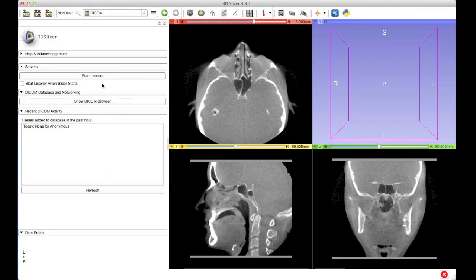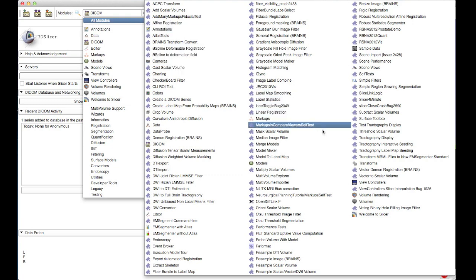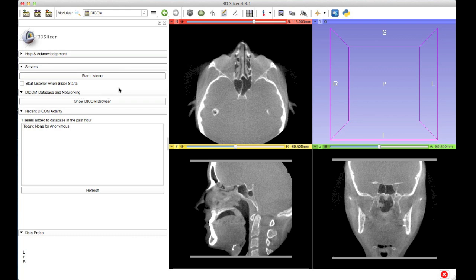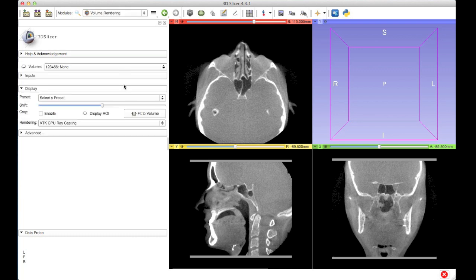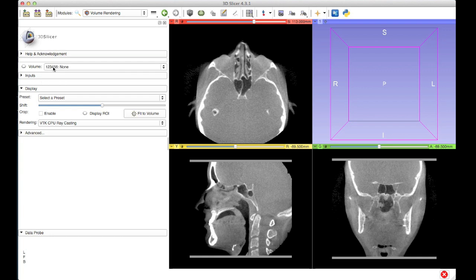I really have a number of ways that I can load it — I can search for volume rendering using the magnifying glass, or I can load the full list of modules and find volume rendering from among those, or it's listed as one of the core modules in this drop-down menu. So I'll click on volume rendering, and the left part of my interface changes. You can see that the first option here is which volume I actually want to render, and there's only one choice in that list because I've only loaded one series. So I'm going to turn on the volume rendering for that cone beam CT, and it's loading now — there it is.